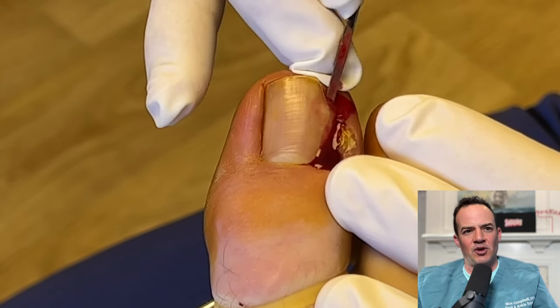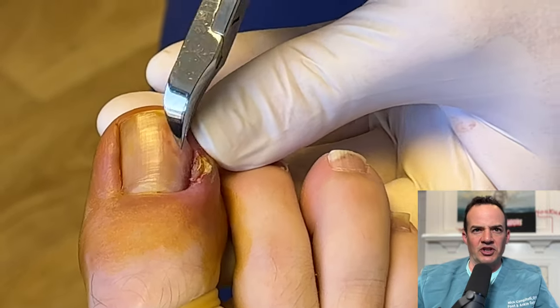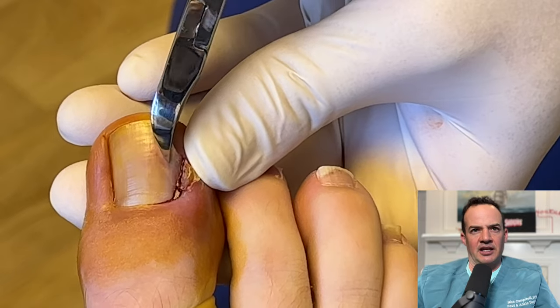We use a freer to first start the process and free up the toenail. After that's done, we use a nail nipper to just cut the corner of the toenail that we're going to then completely cut out.